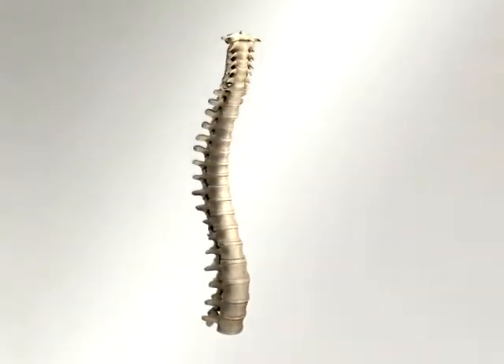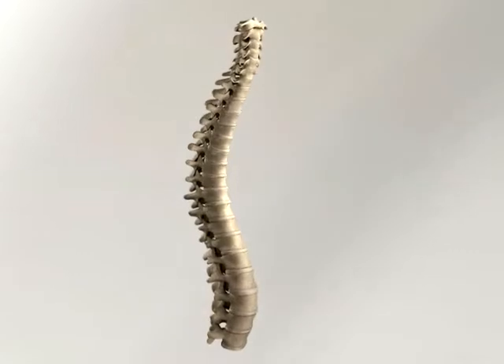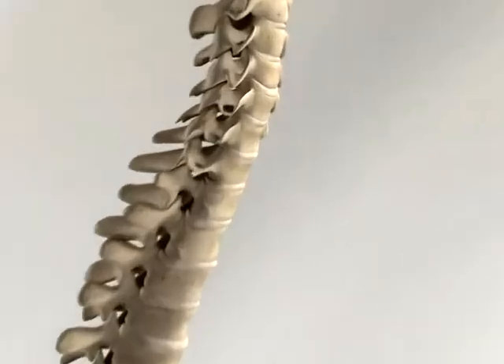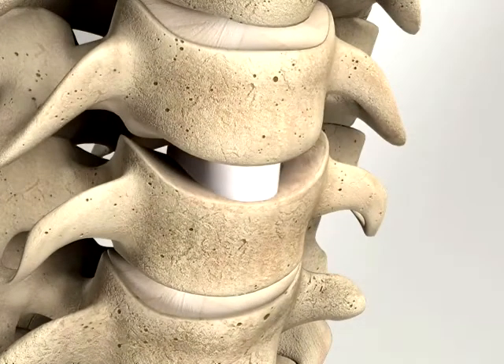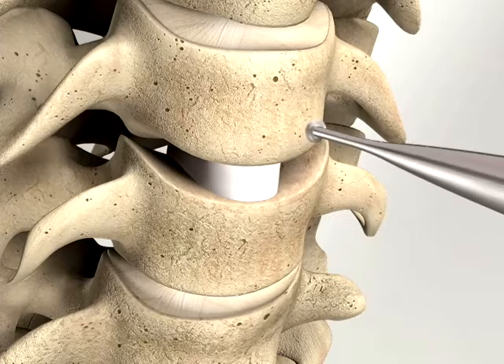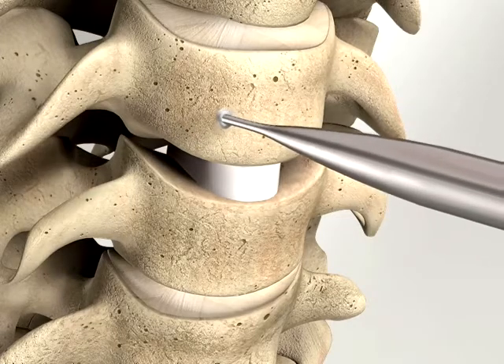Removal of all disc material back to the posterior annulus is completed, and a block bone graft is inserted into the intervertebral space. Thorough decortication of the anterior aspect of the vertebral bodies with either a burr or rongeur prepares a smooth, even surface for the placement of the Inion S1 plate.